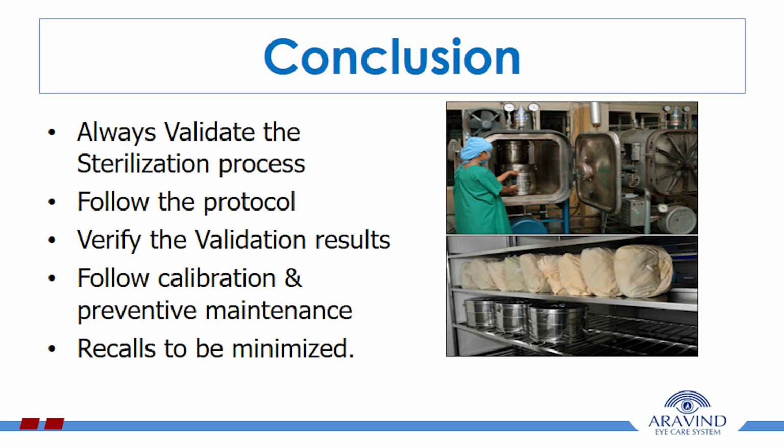Conclusion. Always validate the sterilization process, follow the protocol, verify the validation results, and follow calibration and preventive maintenance, so that recalls can be minimized. Thank you.